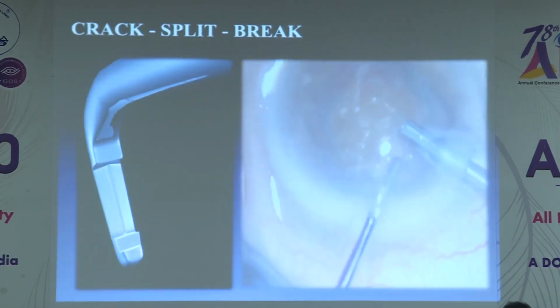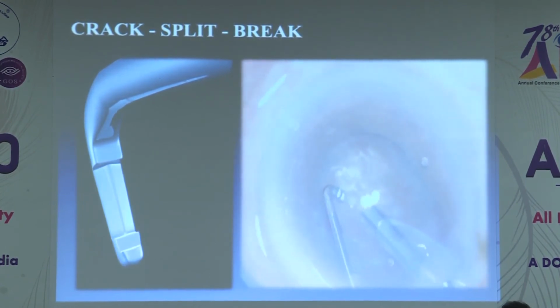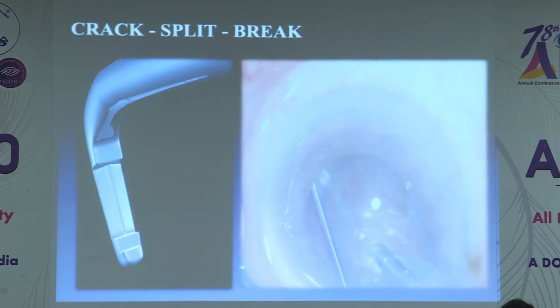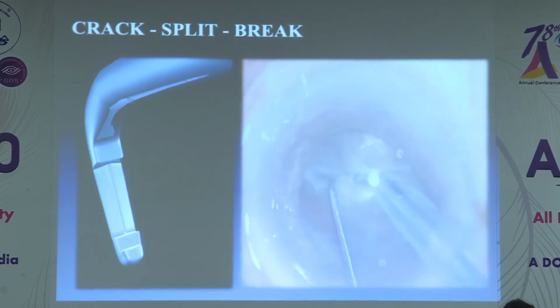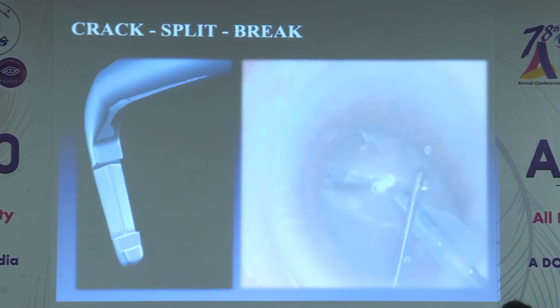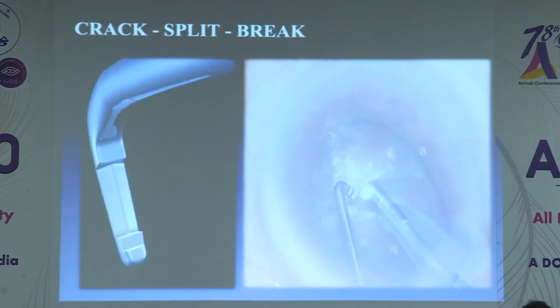You can see how it works, because this is one of the very hard nuclei. You can see here a grade 5, grade 6 nucleus. It would have been very difficult to crack otherwise, but here with this device, you hold it, hook it around very simply, even with a very small pupil, and you see the crack. So this is the crack you get. You can crack these hardest of hard nuclei so simply, even with a smaller pupil.